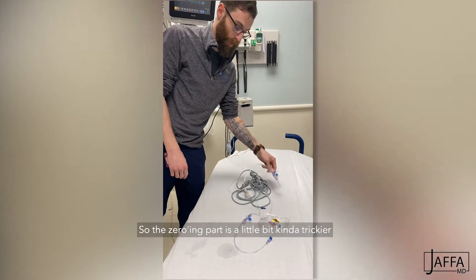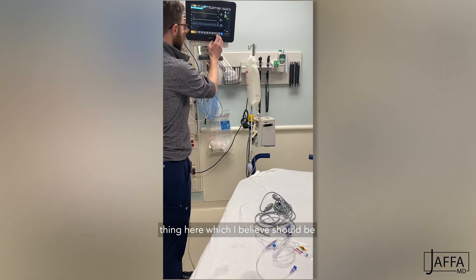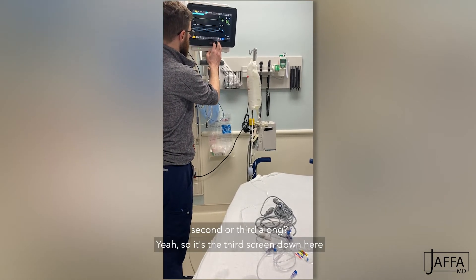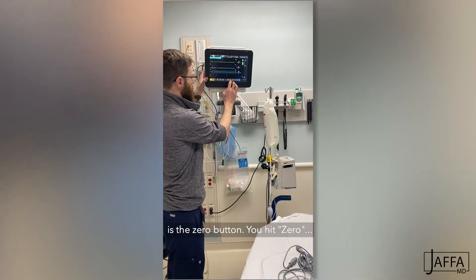The zeroing part is a little bit trickier, but what you do is find your way to the screen — I believe it should be the second or third along — it's the third screen down here. This is the zero button. You hit zero.